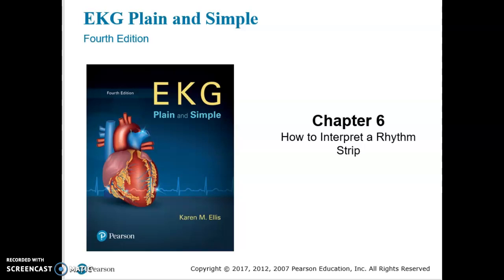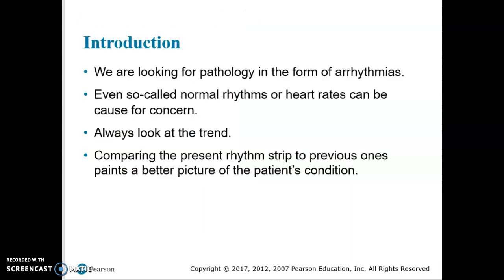Chapter 6, Video 1. Today we're going to talk about how to interpret a rhythm strip. Guys, this is probably the most important chapter as far as moving forward and understanding what type of rhythms that we are looking at, okay?